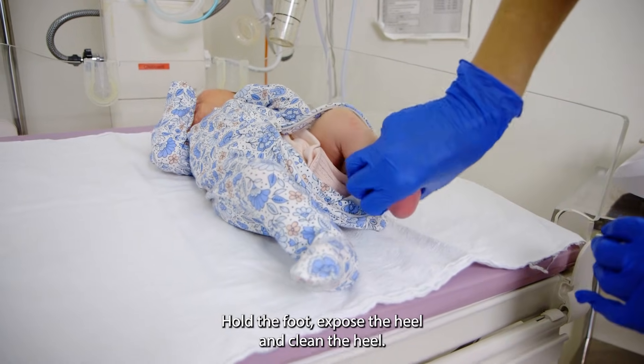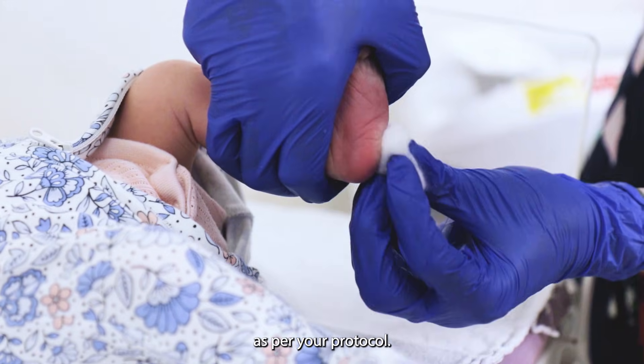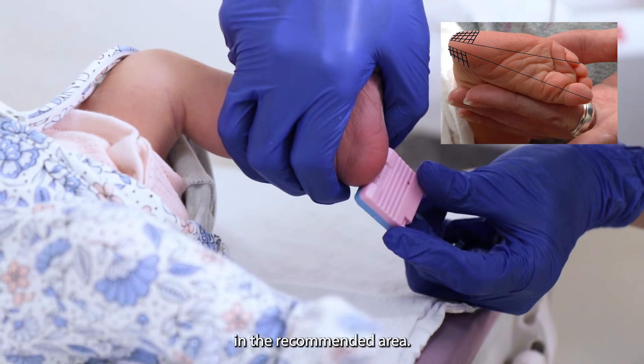Hold the foot, expose the heel, and clean the heel as per your protocol. Puncture the baby's heel in the recommended area.